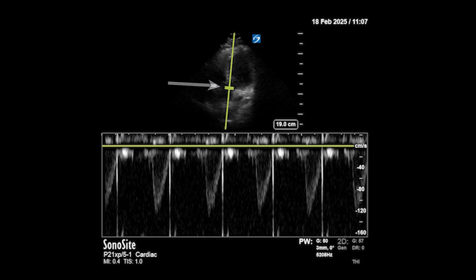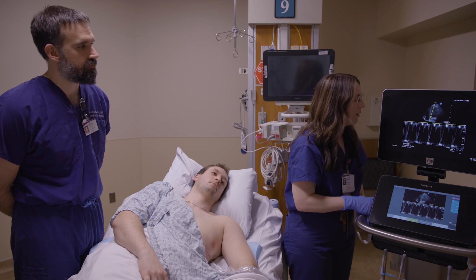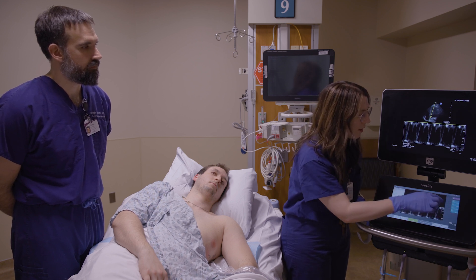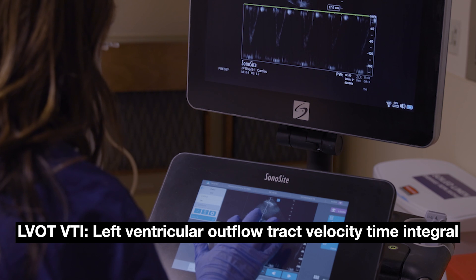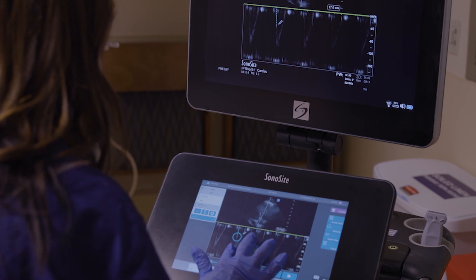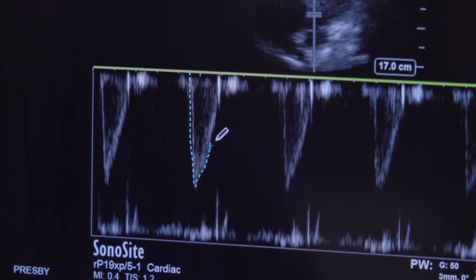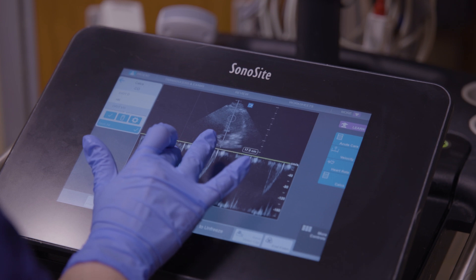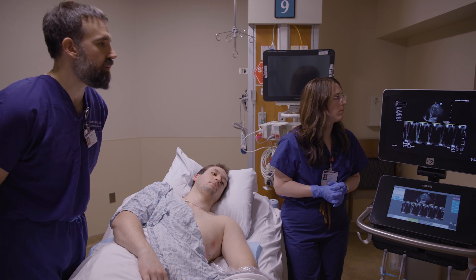On the x-axis is time, and on the y-axis is velocity of blood flow at the point of the Doppler gate. Lauren opens the calculators to trace the outline of the LVOT waveform to get the LVOT VTI — velocity time integral. You integrate velocity over time, giving you an area under the curve. Modern machines can do this automatically. The resulting LVOT VTI value is 24.1.